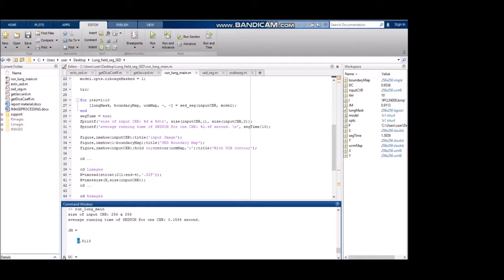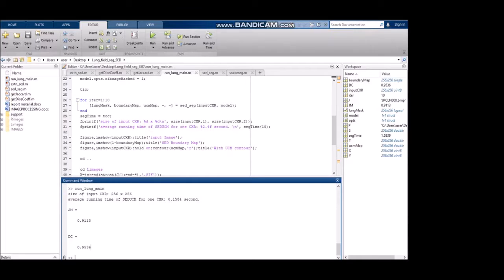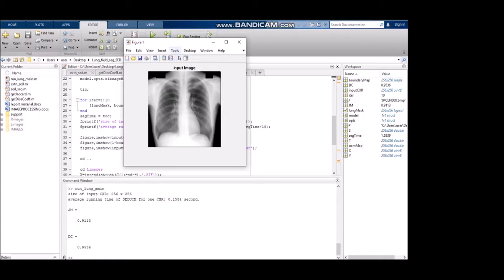The execution time is shown, and the Jaccard index is in the order of 0.91, while the Dice coefficient is 0.95. As much as these values are closer to one, the lung is said to be in a normal state. If both parameter values are closer to zero, then the lung needs to be looked at — this is an anomaly foreshadowing in the lung chest radiography.